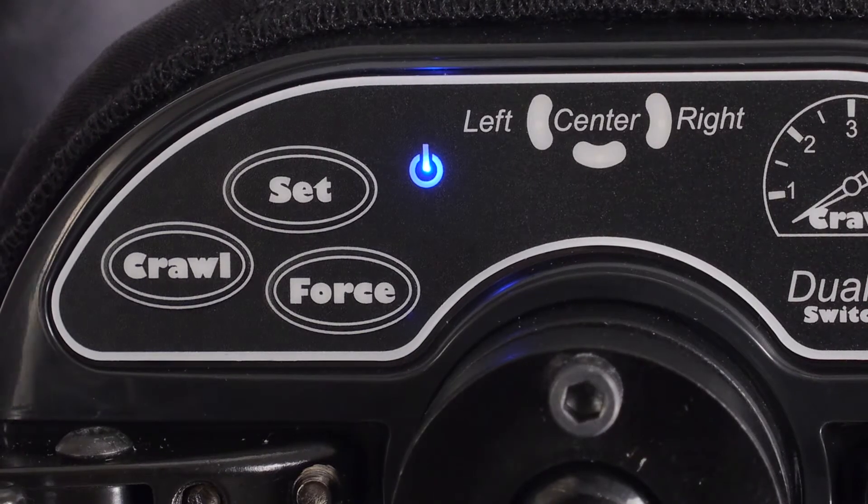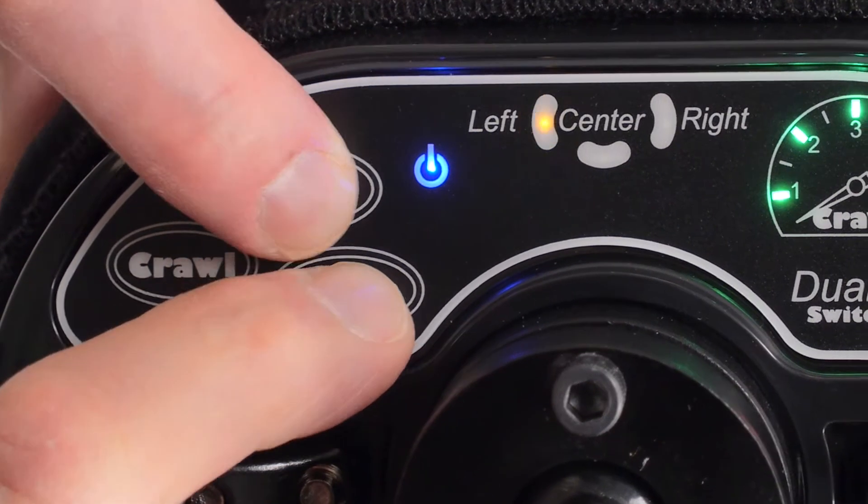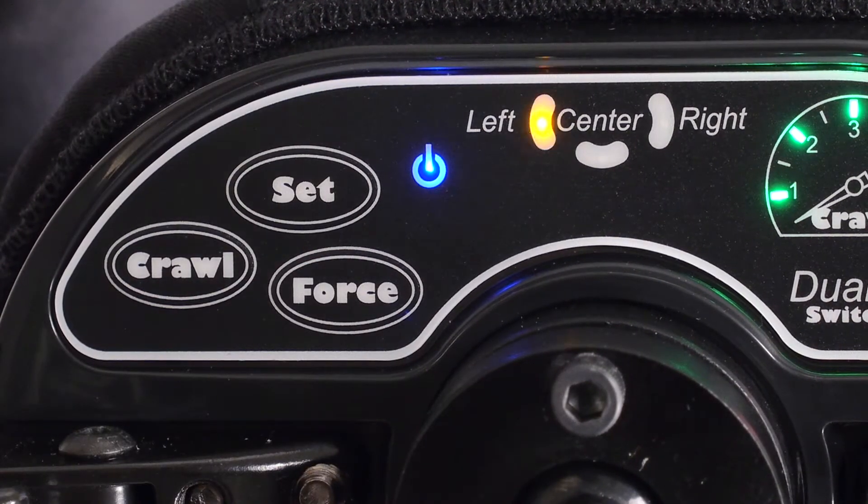To enter the programming mode, press Set and Force at the same time for 3 seconds until the left pad indicator light starts flashing.